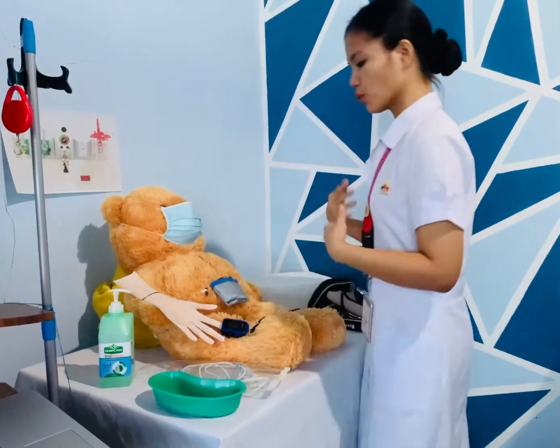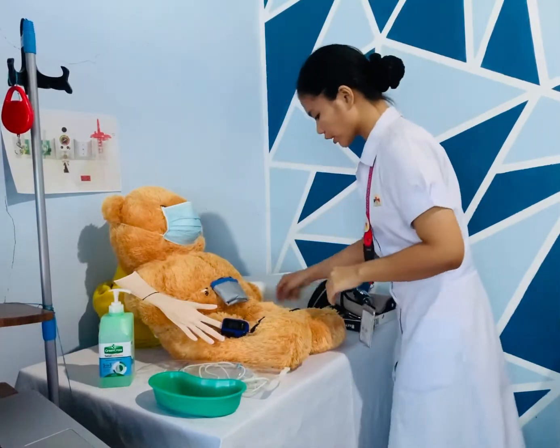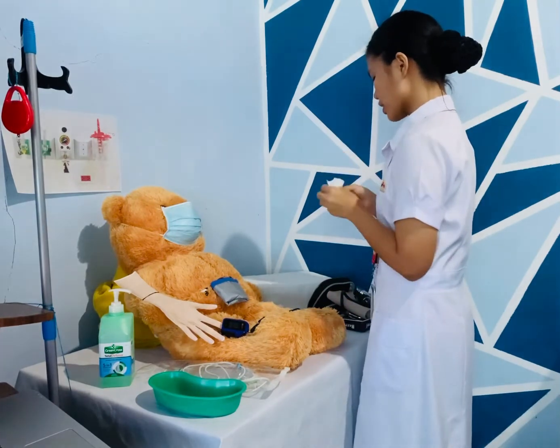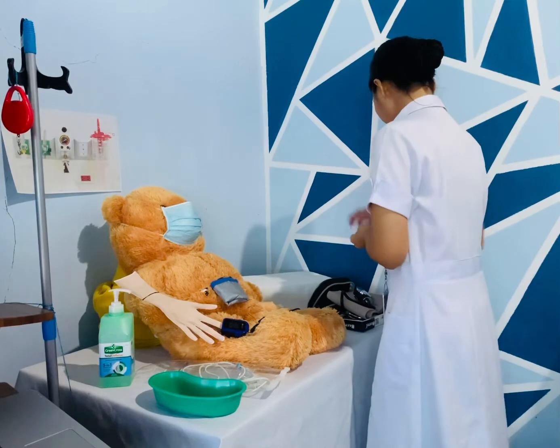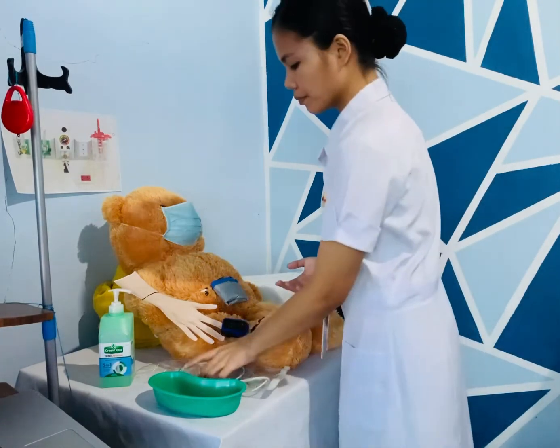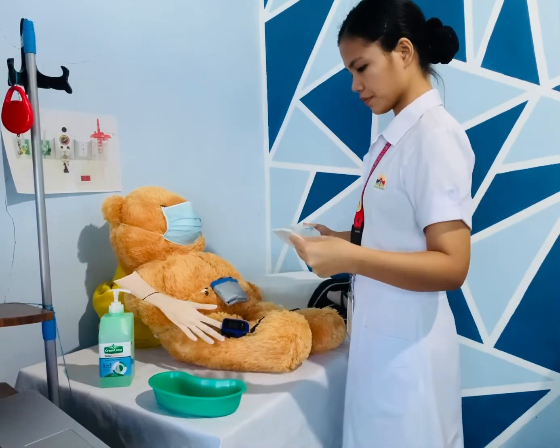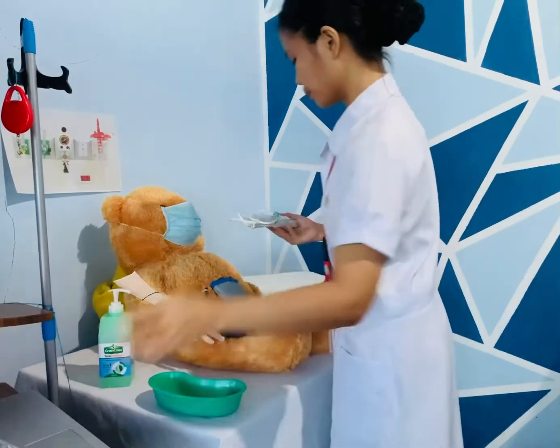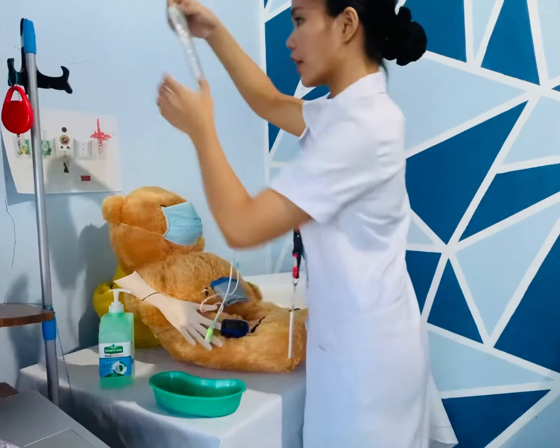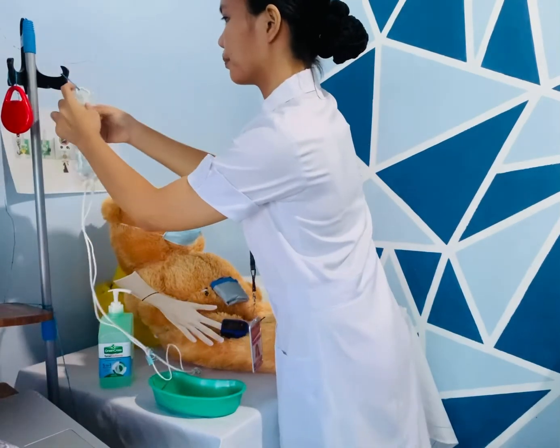Ayan. Then do again the hand washing. Dry hands with a clean paper towel to prevent again the spread of microorganisms. And after that, I will now get the dialysis solution. Okay, remove it from the outer pouch. Then hang the dialysis solution in the drip stand.